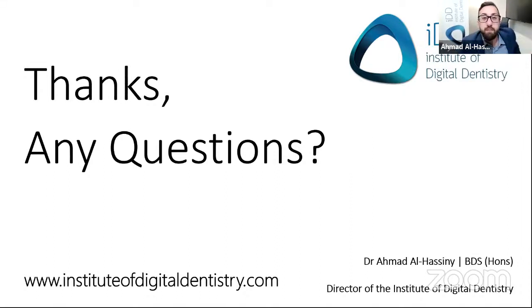How often do you need to calibrate the scanner? That's a great question. It comes up with a message when you need to calibrate it. The Medit software is very user-friendly. It just tells you need to calibrate now. I like to routinely do it every maybe 3-4 days. Again, something your nurse can do either at the end of the day or before a big treatment. If it's a very vital treatment, like a full arch restoration, I'm calibrating.